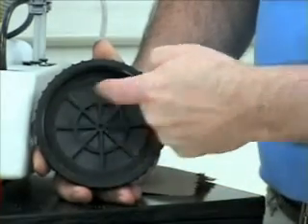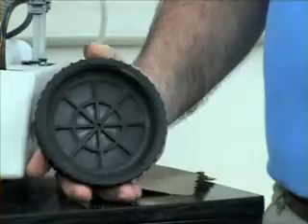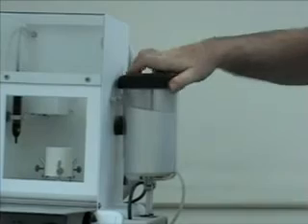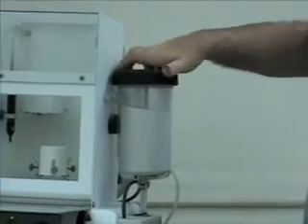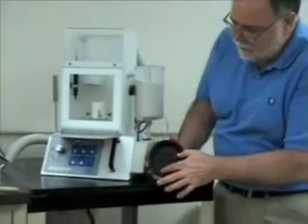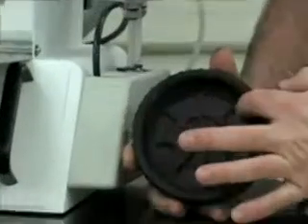It's reasonably flat, but what we're going to do now is place the lid onto the jars, run it on real quick, and give it a nice little snug down. And then we're going to back it off and inspect it real quick, just to make sure that we've got the ring seated flatly into the groove. It's reasonably flat. I run my finger along there.